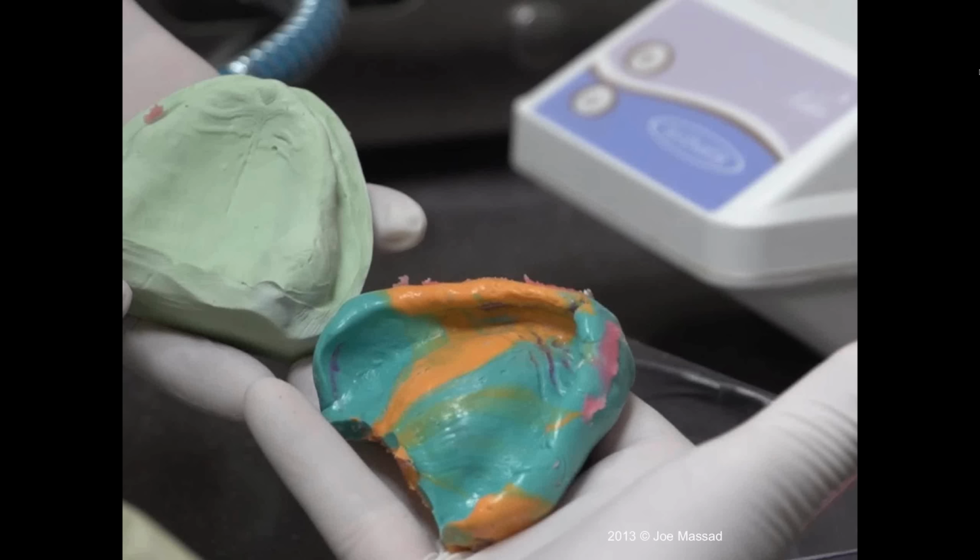I'd like to emphasize that you have options today for both the dentists and prosthetic technicians to think about. The technique I suggested for impression making is only one of several. It's the one that we use because it keeps us straight. It keeps the hand from rotating. It gives us the thickness of impression material that we need in the elastomerics to be accurate.